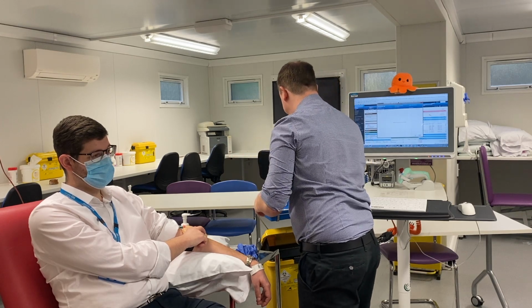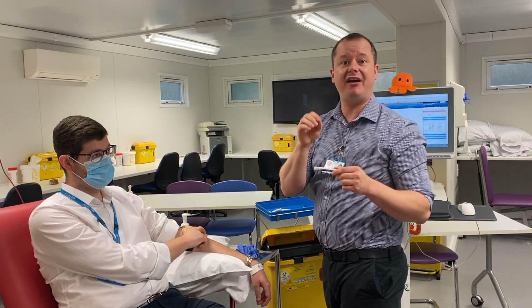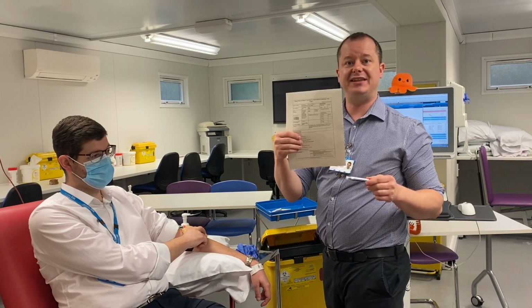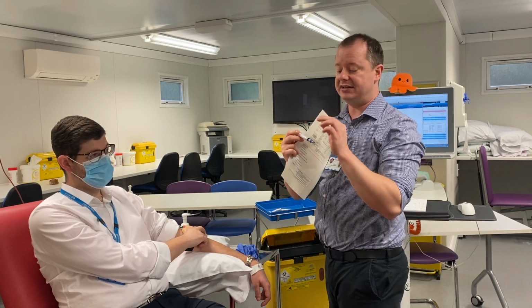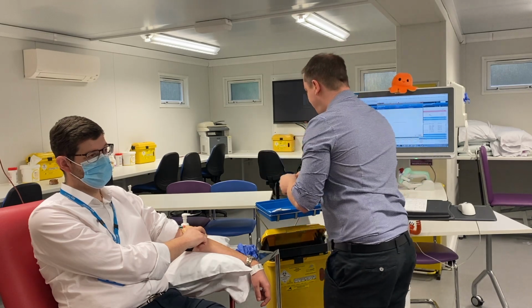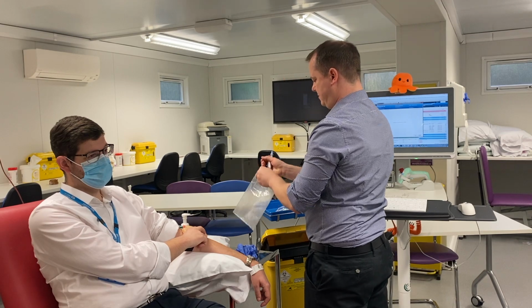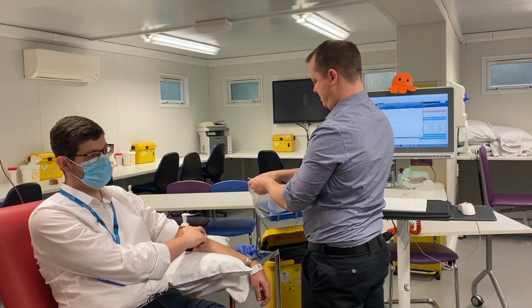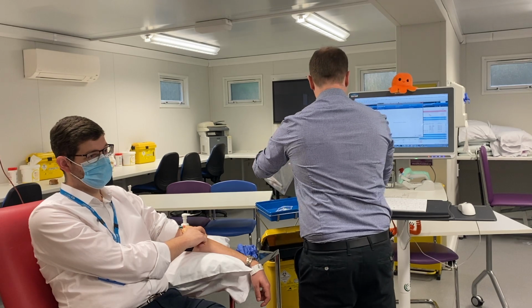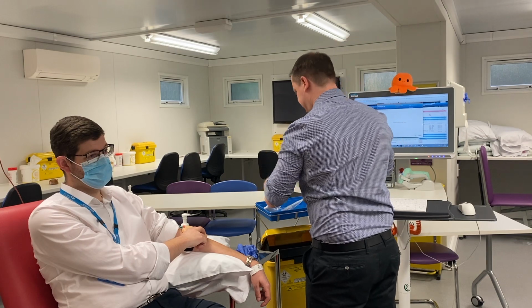And then for my blood transfusion sample, I'll need to hand write that bottle out, making sure that I sign and print on the actual paper form, and write the date and time that I took the bottle, and sign onto the bottle as well. Once I've done all that, I then place them all in the specimen bag with my blood transfusion form, which is signed and printed.